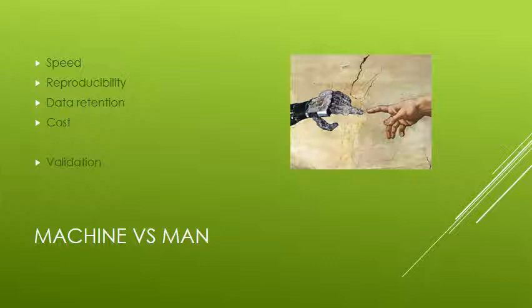Instrumentation doesn't always reduce costs, so you do have to weigh the differences. Am I getting so much more benefit on the speed, reproducibility, data retention side that it actually justifies the cost that you're going to include in this?